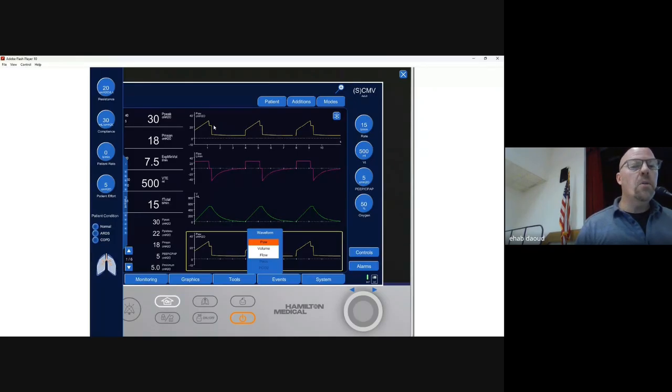In this situation, if you're concerned about the intra-alveolar pressure, you can see that the peak airway pressure is 30, which might cause some concern based off of your ventilation practices. But the real plateau pressure is a fraction of that. And this plateauing inspiratory hold that you see here, if you draw it back to the y-axis, it's somewhere around 21. So if you were clinically concerned that your peak airway pressure was high, you have the ability through a simulator to put an inspiratory hold on and say, hey, look, actually it's not.